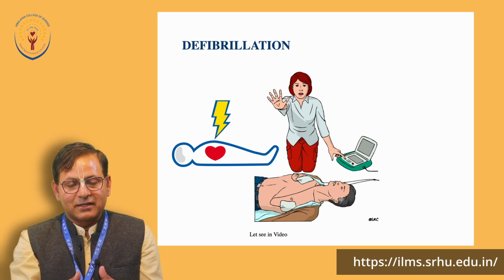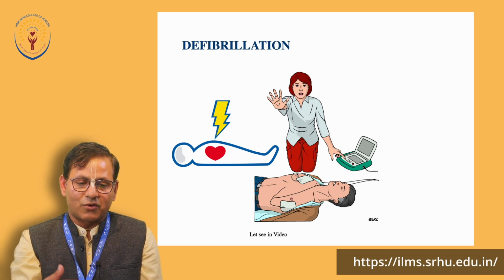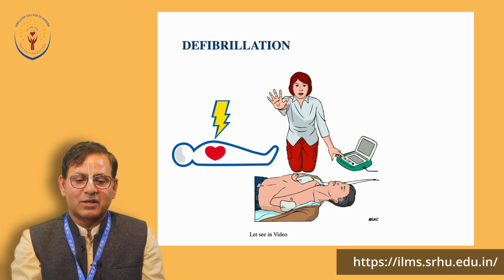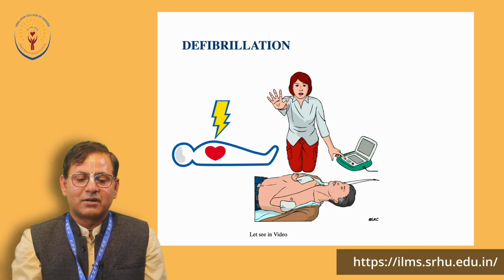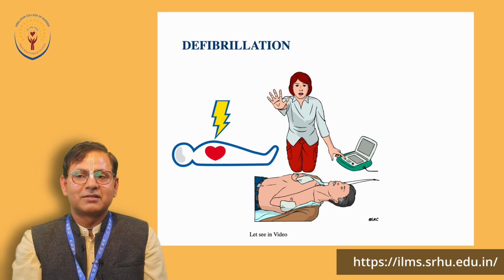After placing the pads, it gives some instructions, and in the end it will say that the patient requires a shock, then it will charge. Before giving the shock we have to ensure that nobody is touching the patient, and after giving clarification like I clear, all clear, we give the shock to the client. Now, let us see in the video how to handle this AED.